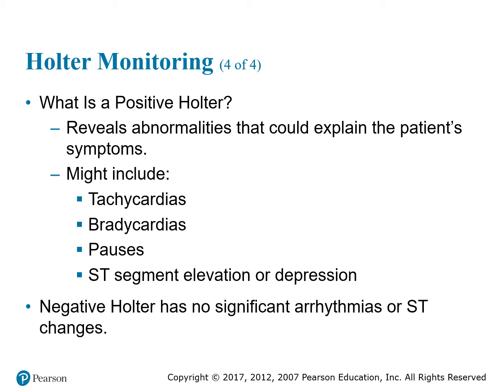Also, we tell the patient that they must not tamper with the monitor or disconnect the leads or electrodes while on the monitor. They are only allowed to take a sponge bath, never ever a shower or a tub bath during monitoring time, because the equipment can't get wet because it is battery powered. Remember, it is an electrical device. You definitely don't want them to submerge themselves in water and shock themselves. So make sure we are clear and concise. You can tell the patient that they can only take a sponge bath, never ever a shower or sit in the tub while they're hooked up to the Holter monitor.